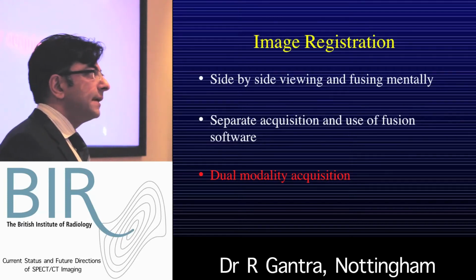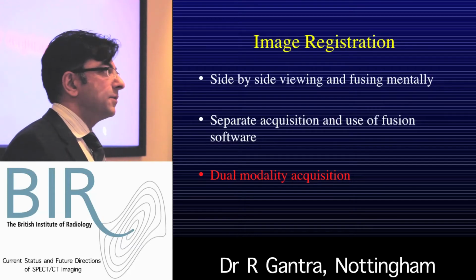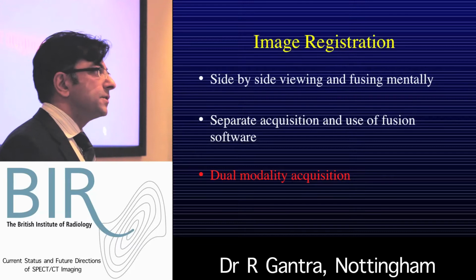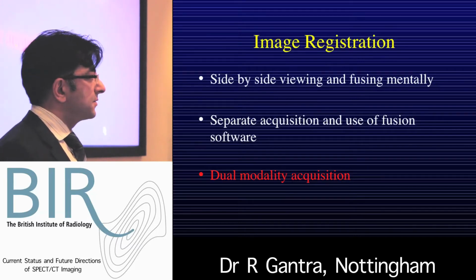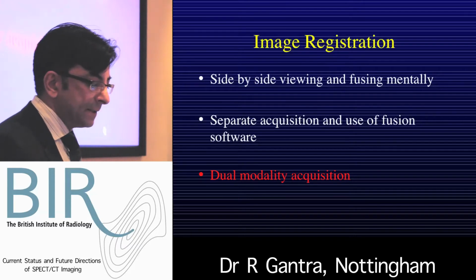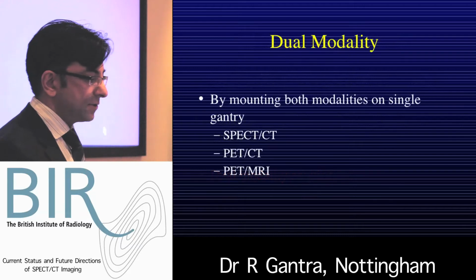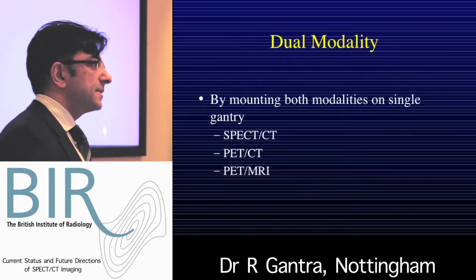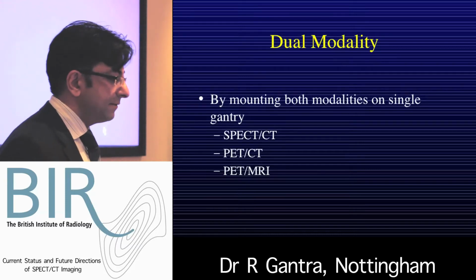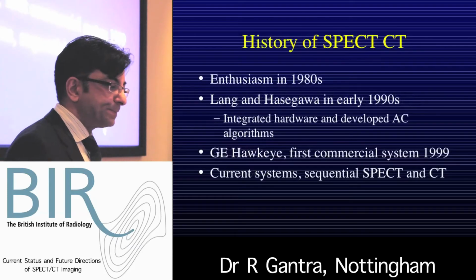And manufacturers have really taken on the mantle of developing dual modality acquisition as a challenge that we've set them, because we want to view the functional and structural data sets together, preferably co-registered, to make our lives easier. And hence, we've come to this hybrid technology that we're talking about. And it's not just SPECT CT, obviously PET CT is around, and I'm sure all of you know that we've introduced our first PET MR in the UK, and that's now becoming available throughout.